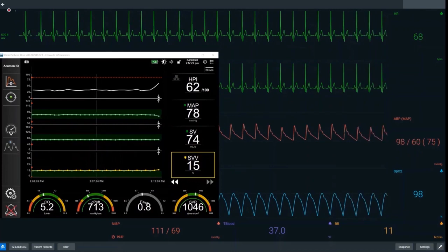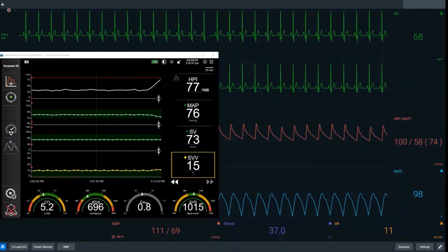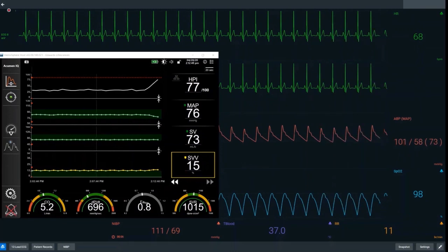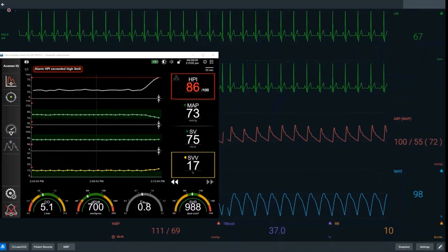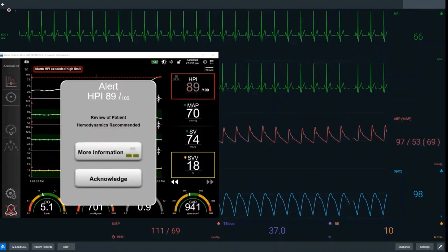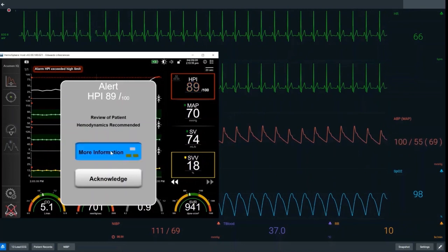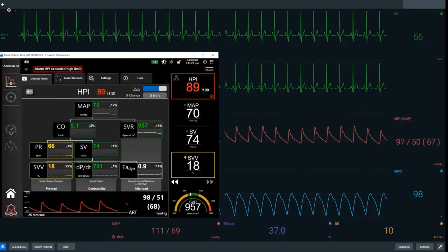By preload responder, we mean that giving fluid will increase this individual's stroke volume. We can see early on in the simulation that HPI is starting to increase, suggesting changes in the underlying cardiovascular physiology. HPI is the patient's likelihood of trending towards a hypotensive event, defined as a MAP of less than 65 mmHg for greater than one minute. HPI alarms above 85, and we'll get visual recognition of that to alert us that hypotension is likely to occur.